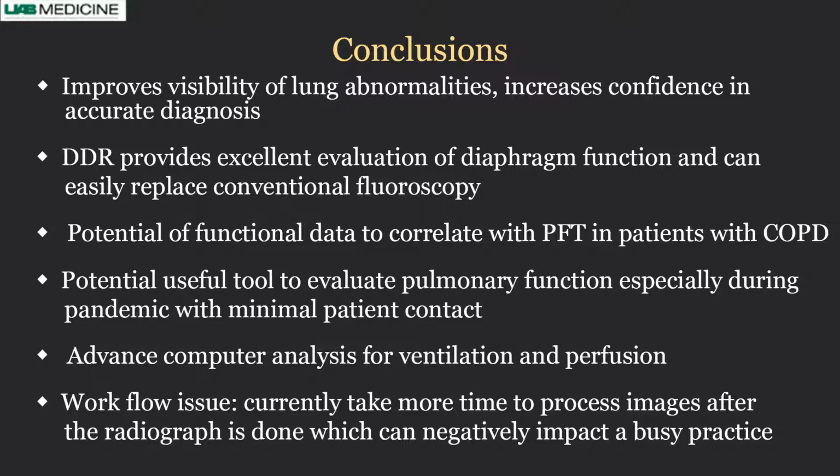The potential of functional data correlation with pulmonary function tests, I think it is huge in COPD, whether it's asthma or chronic bronchitis or emphysema. It can also be potentially useful in a pandemic area where you cannot do PFTs, but you can get a broader picture of pulmonary function from DDR. Advanced computer analysis for ventilation and perfusion, once they are mature, can be very useful.